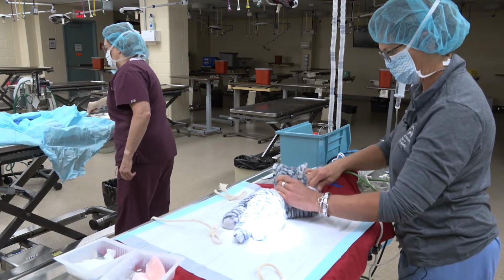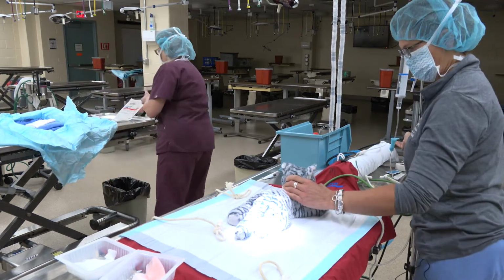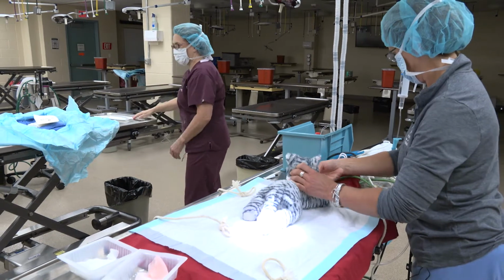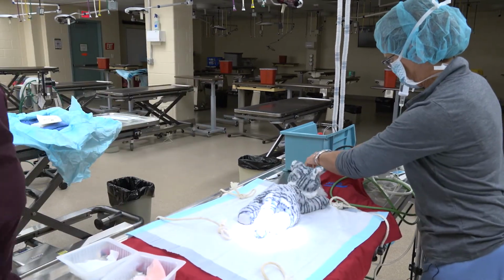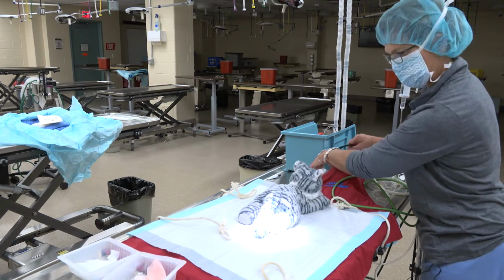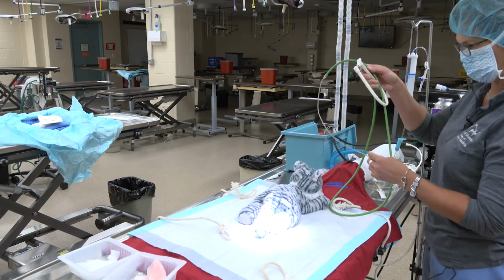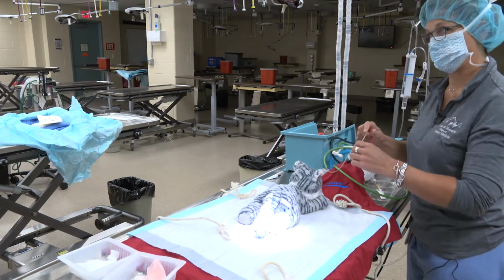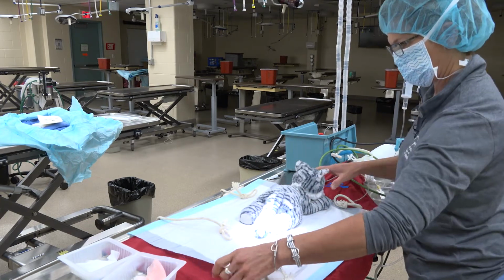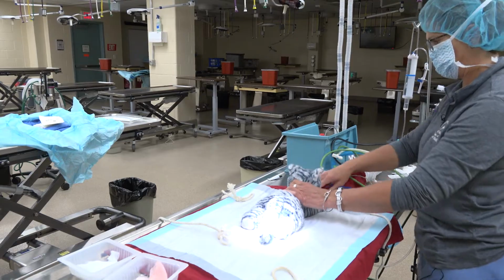Realize you guys haven't had that yet, but I'm going to start the oxygen first and then attach, making sure our pop-off is open here and that our bag has room. Setting our monitoring equipment, including the esophageal stethoscope, which goes in the esophagus. And we're going to get ready for our surgeon to prep.